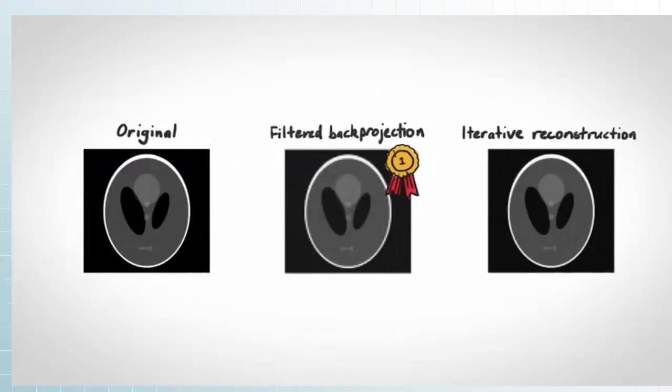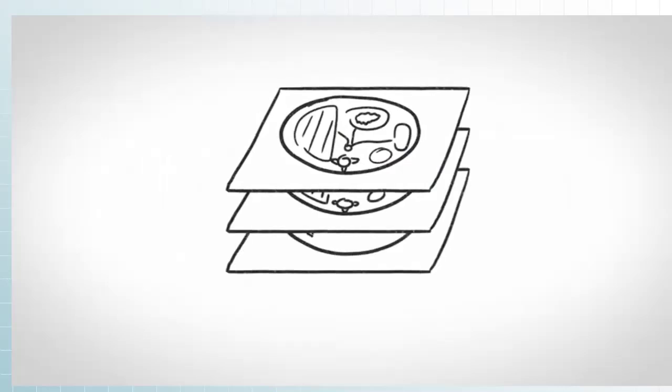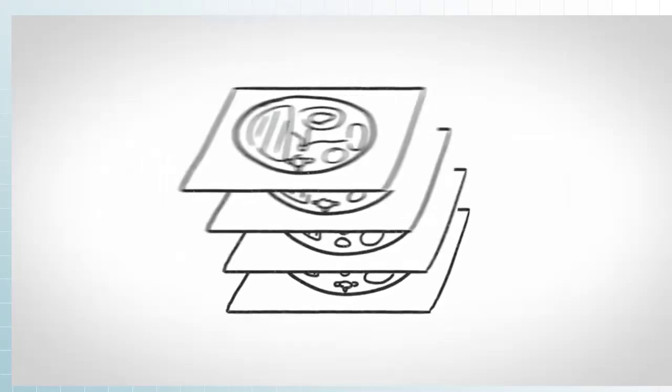Now, with computers becoming fast and powerful, the iterative reconstruction method has become the norm. So with that, what we can do with one slice of the body, you need to repeat this whole process for the rest of the slices in the body part you want to image.